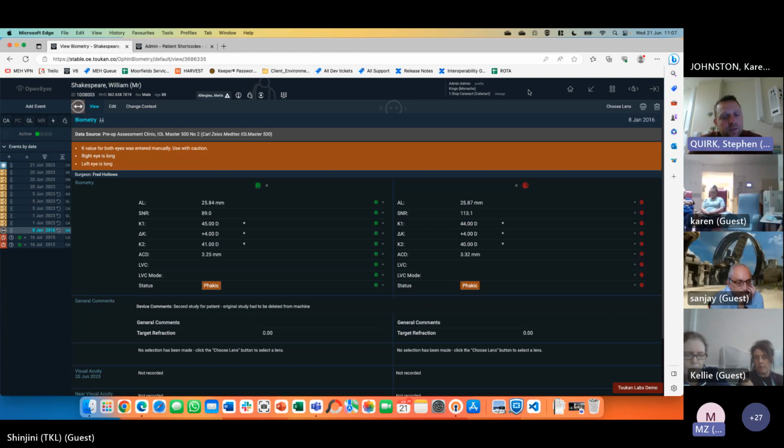So obviously this is a bespoke ophthalmology EPR. The trust are moving towards a wider EPR. So the longer term plan is all services will move on to the trust-wide EPR, but obviously that's a huge piece of work. And I know Nicky's touched on it in some of the directorate meetings and the planning meetings that we've had. There will be a transition phase when we get our hands on Open Eyes full, after the testing, where we still have to order notes when relevant. It's going to be a longer process. We can't just flick a switch and move everything to EPR in the trust, but we'll be one of the first services to do it.